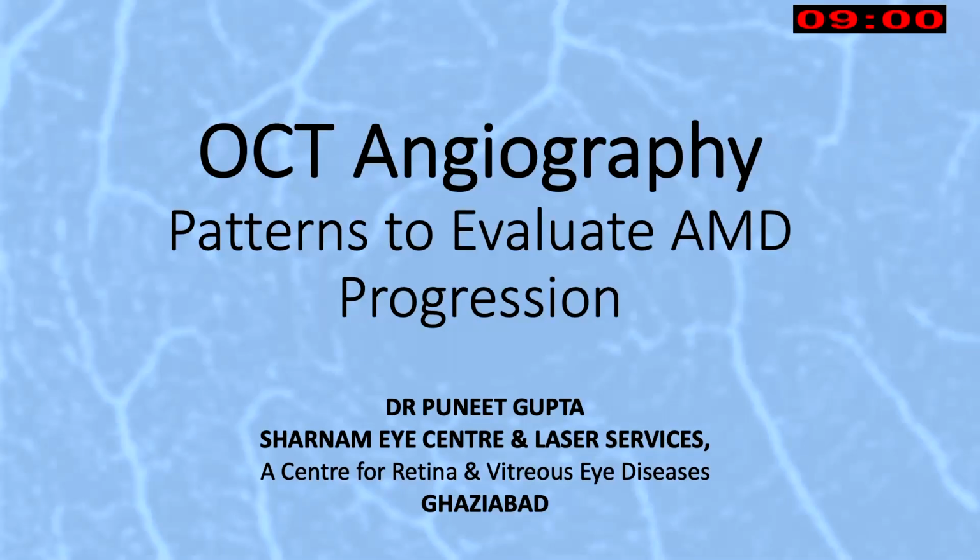Can I add a comment for Lalit sir's talk? I think, sir, in spite of OCT angiography jumping leaps and bounds, I still feel wherever we are stuck in a doubt, we always fall back to the gold standard of dye-based angiography, whether it is fluorescein or ICG. A lot of cases I know OCT angio can pick up things, diagnose, but when we are stuck with a dilemma, it's FA and ICG, because this is the only one which is actually showing us the vascular dynamic flow, and it can pick up things like leakage, which nowhere an OCT angio can help. So I still feel it is nowhere gone. It is going to be there for a lot more time. I don't think we are going to be replacing dye-based angio that easily.